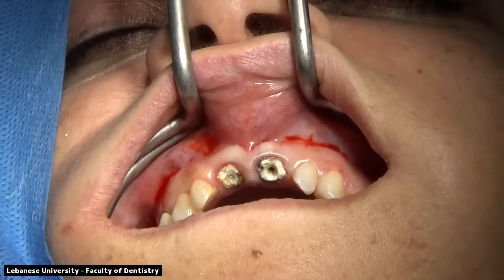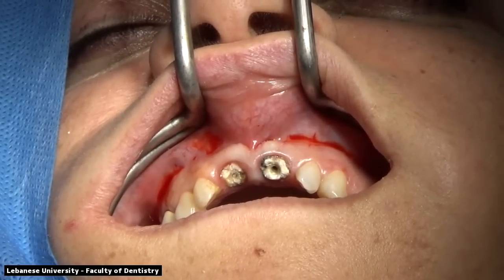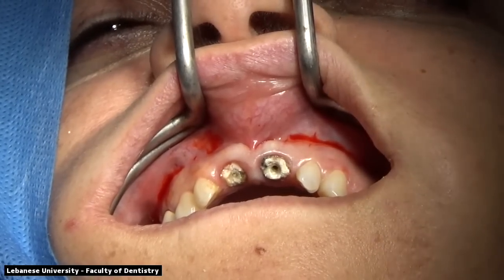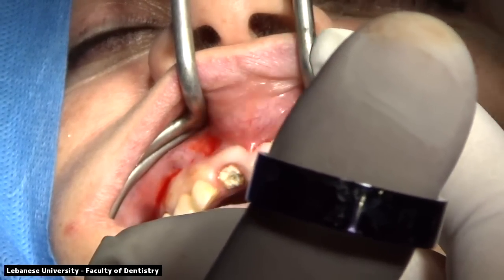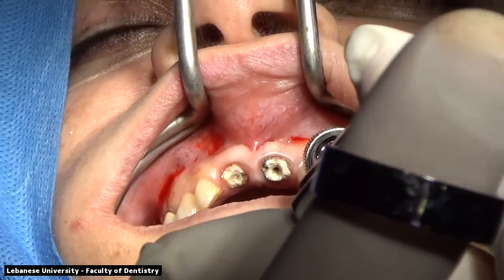Both teeth have been previously endodontically treated and they were fragile. There was recurrent decay on the left central as well. Both teeth were deemed unrestorable by the prosto department, so they suggested that we extract them and place 2 implants in their place. The implants that will be placed are tissue level implants.